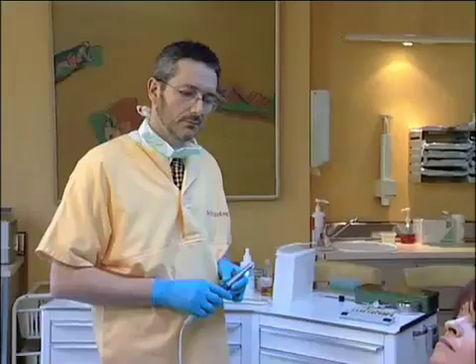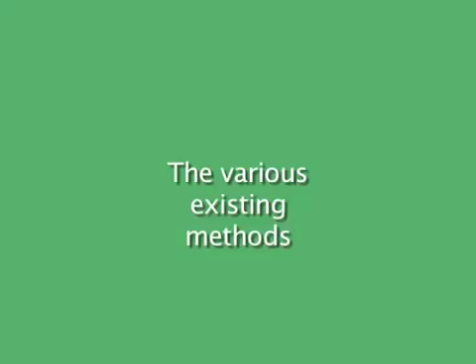Shade selection and its communication to the prosthesis lab is an act often feared by practitioners and improperly performed. The influence of the light ambient environment. The vision of color can be affected by the immediate color environment of the patient's teeth.